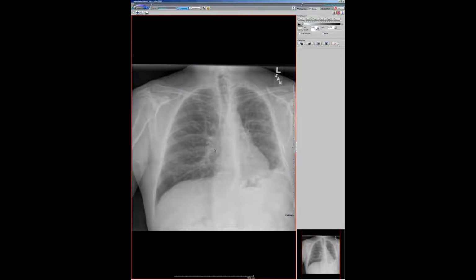So, when I first saw the chest X-ray, I thought it would be a pretty simple diagnosis. We've seen a lot of these where you have a small lung and you get this pleural thickening around one side, and then these little subpleural scarring on the small lung. And I think this is a very typical appearance for whatever you want to call it, unilateral hypoplasia, unilateral absence of a pulmonary artery. So this guy was sent to us, but that's not what it was.